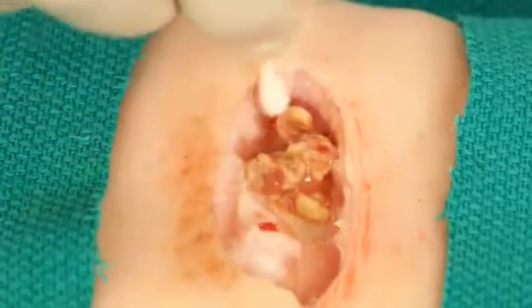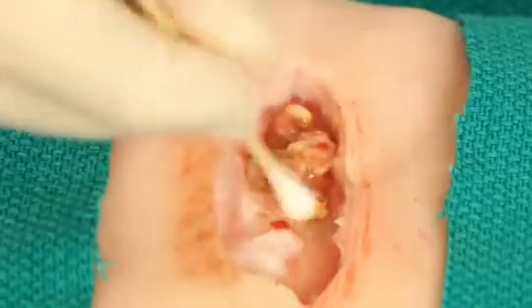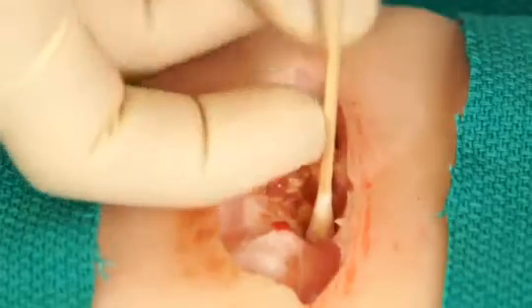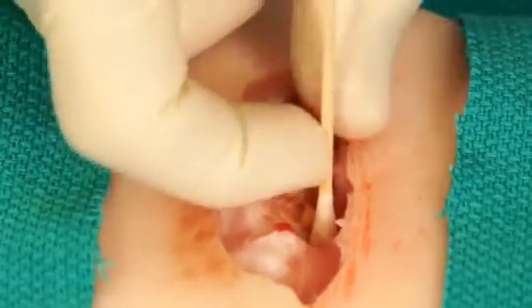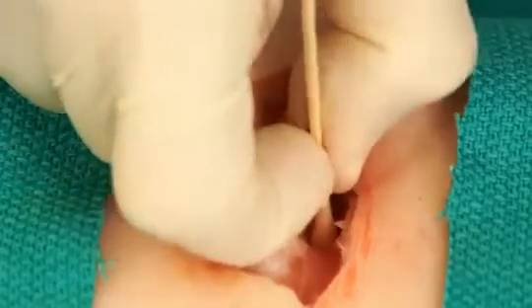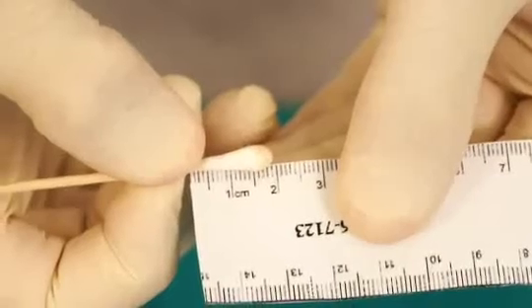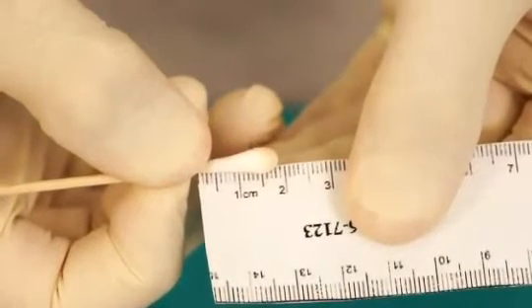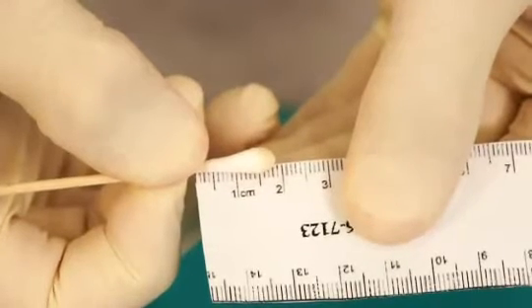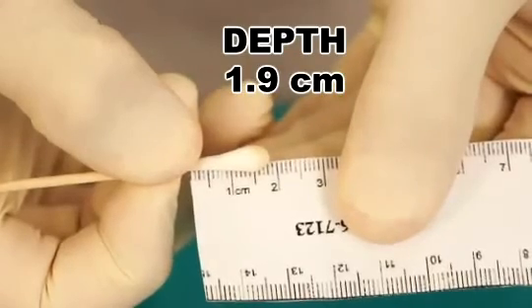The depth we then would determine by probing the wound with our cotton-tipped applicator using the cotton end. We would probe all areas of the wound to determine where the most depth was located. It appears to be approximately in the middle of the wound. We would then slide our finger down the cotton-tipped applicator to where it is flush with the intact skin, pinch the applicator at that point, and withdraw from the wound. This can then be laid over your measuring device and the depth determined. In this particular instance, it appears to be 1.8 or 1.9 centimeters.